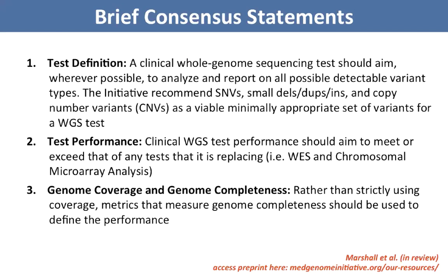Number three is more of a question around genome coverage, because that's a question that a lot of people will ask: what genome coverage do you need? Rather than thinking about genome coverage, there's a statement in there about looking more at genome completeness, and this gets to callability, meaning how well can you call a specific position. These are the performance metrics that should be used to define performance, rather than just straight coverage.